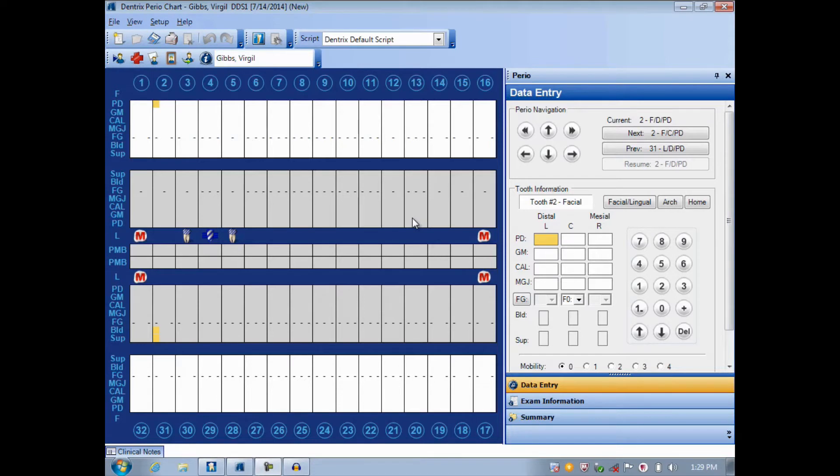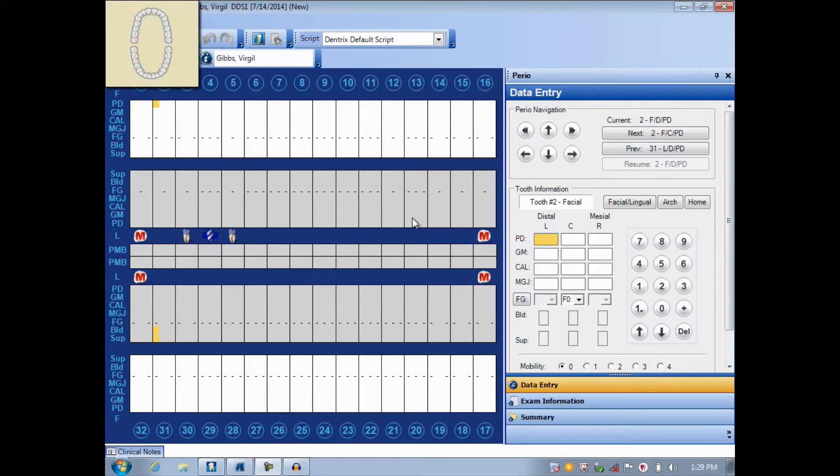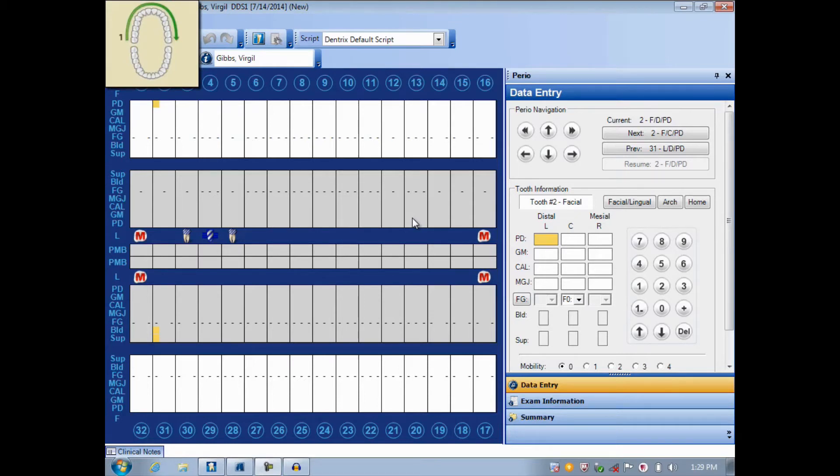Before we begin setting up a script of our own, I always like to have a plan. So let me present to you what my plan is for my script. Part 1 of my script will begin with the facial side of the mouth from tooth 1 to 16 in a left to right pattern.